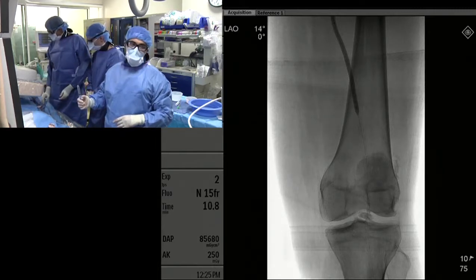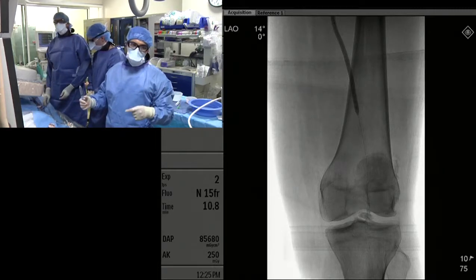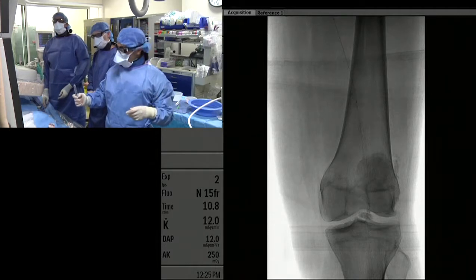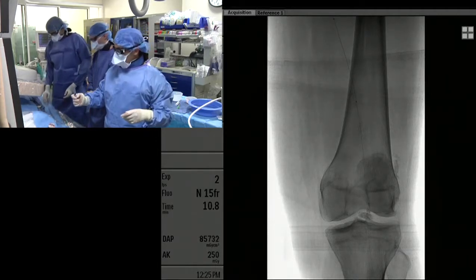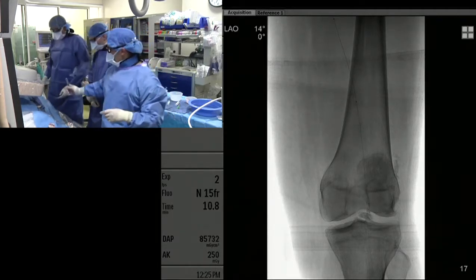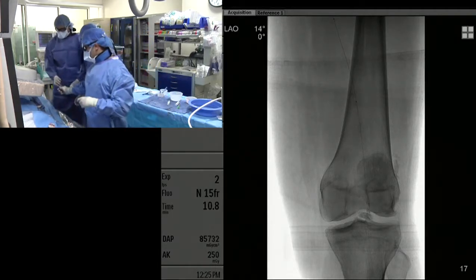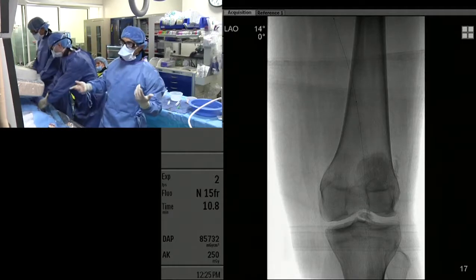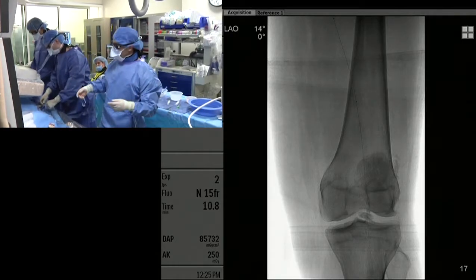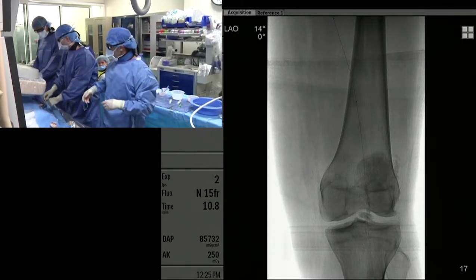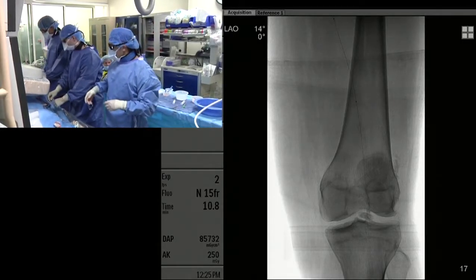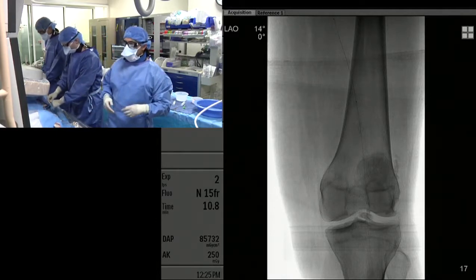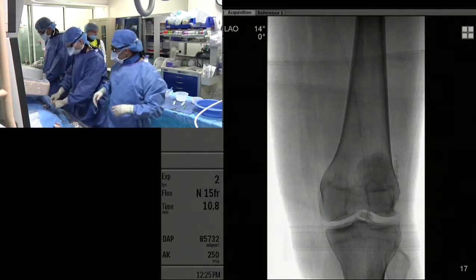So in this specific patient, the Everflex with the Entrust system would work for bailout stenting. We can use that stent specifically in this patient. If she were taller, we might not be able to.